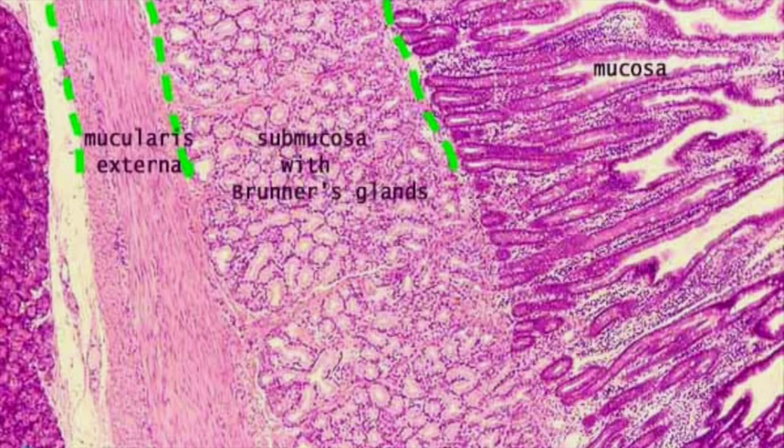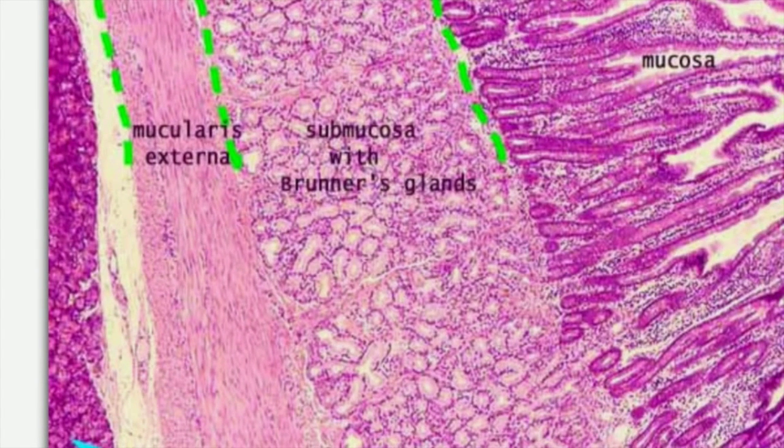You can see here a part of another organ, which is actually the pancreas. These are the pancreatic acini, and it is always related to the duodenum and may come with the duodenum in a compound slide. Here in the section of the duodenum, you may be asked about the type of these Brunner's glands. Brunner's glands, it is a compound tubulo-alveolar. And according to the type of the secretion, it is a mucus gland secreting the mucus.